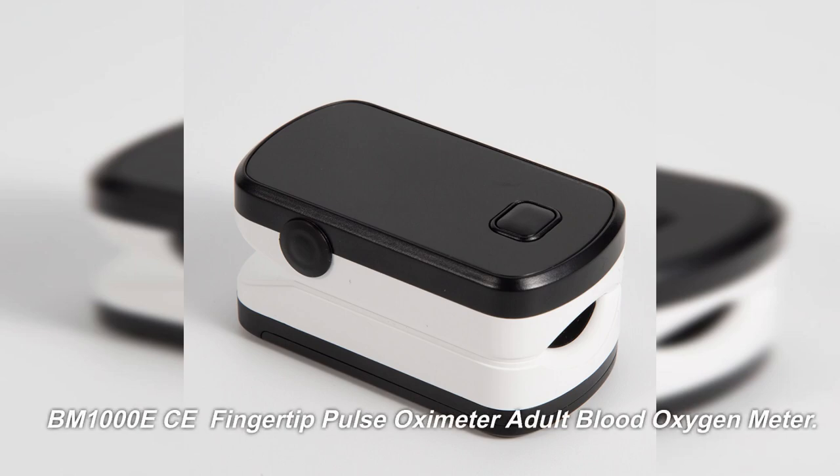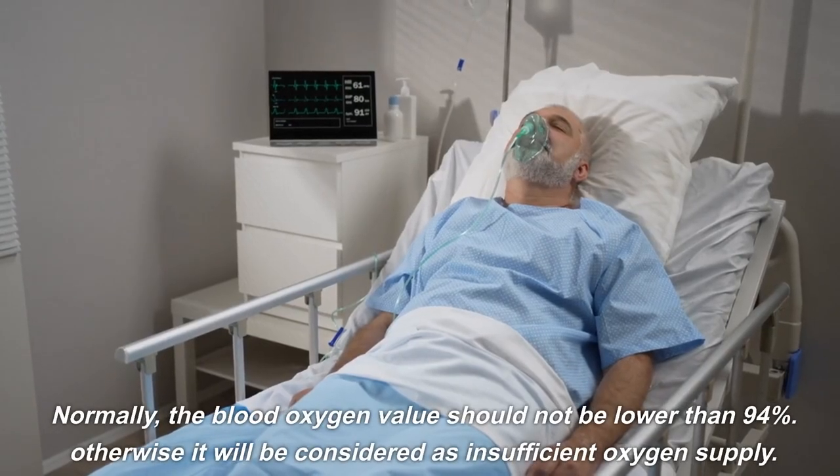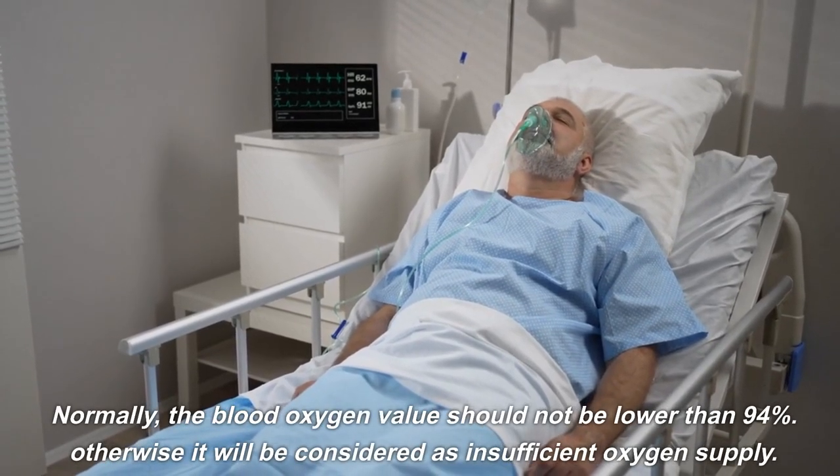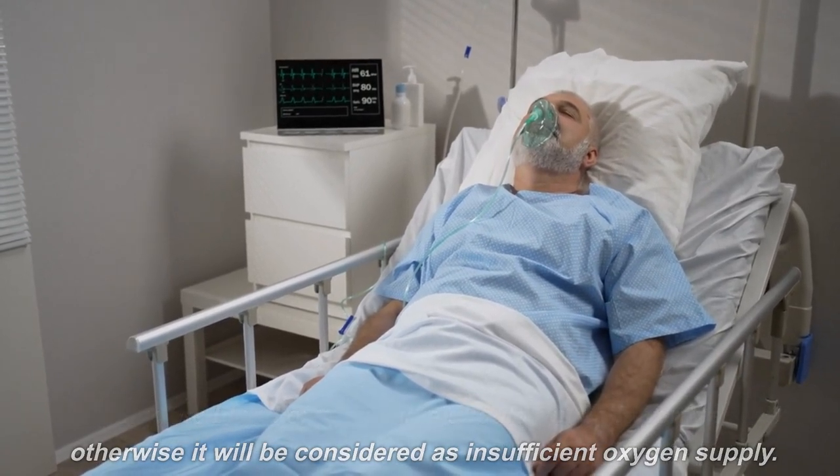BM1000 ECE fingertip pulse oximeter, adult blood oxygen meter. Normally, the blood oxygen value should not be lower than 94%. Otherwise it will be considered as insufficient oxygen supply.